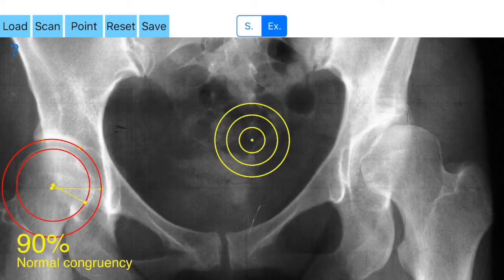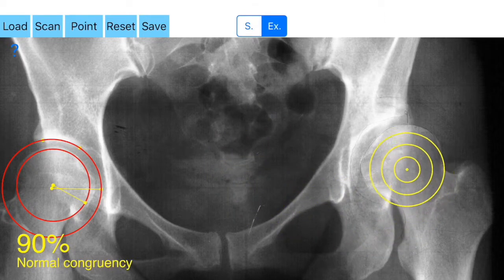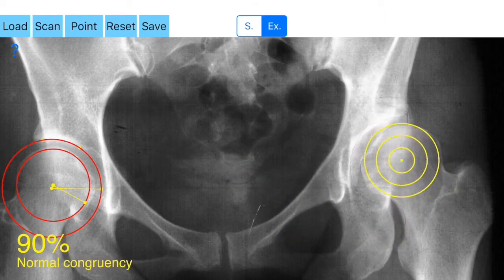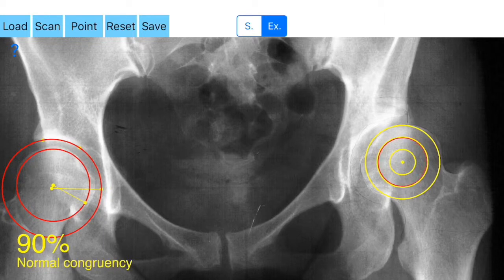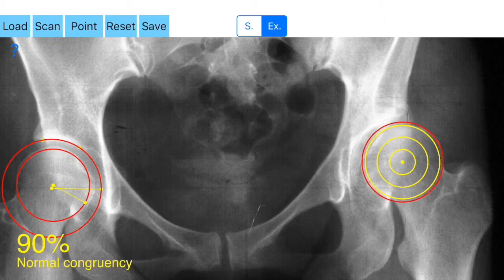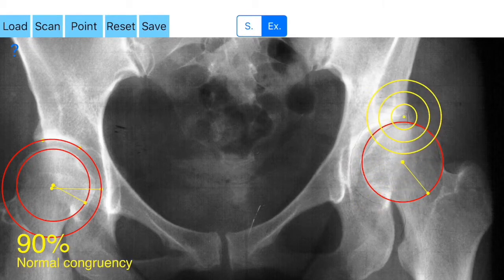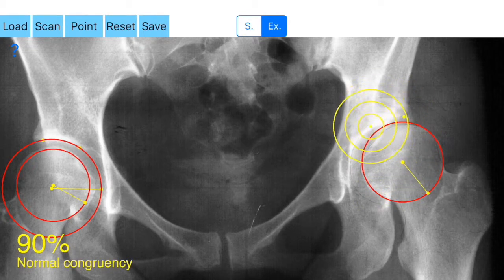After the A3 point, a red circle is printed passing over the A1, A2, and A3 points, and automatically the center of the acetabulum C2 is printed. The app calculates the congruency, and the results are printed as a percentage of congruency and marked as normal or abnormal as mentioned above.